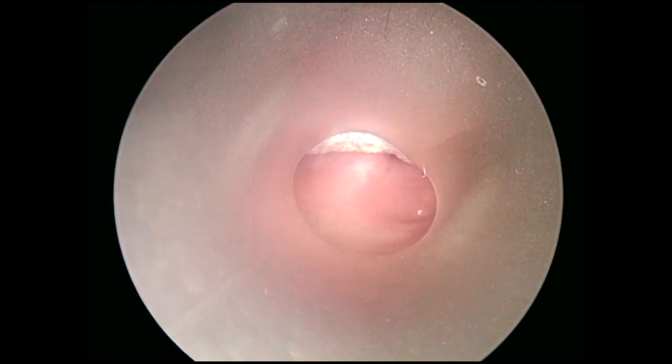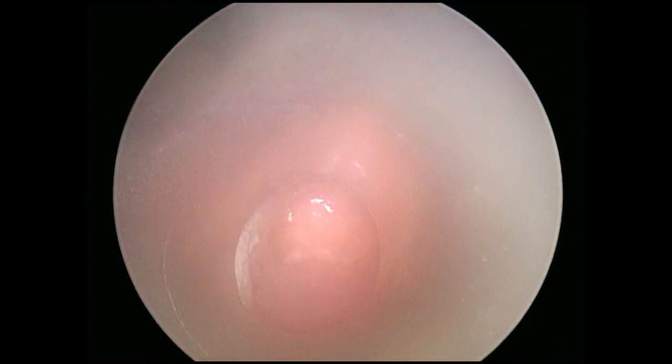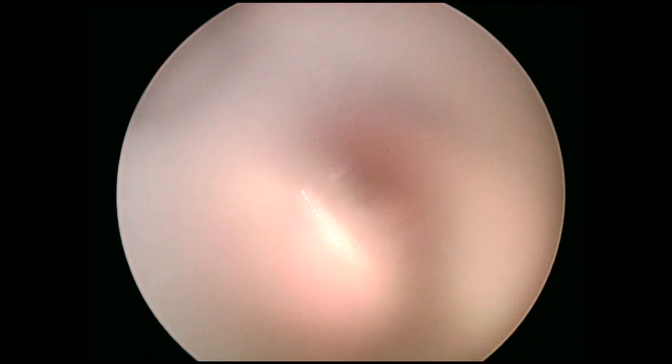The procedure is performed under general anesthesia, spontaneous breathing, and via rigid bronchoscopy. In this case, a size 14 Storz rigid tracheoscope is introduced and stabilized in mid-trachea.